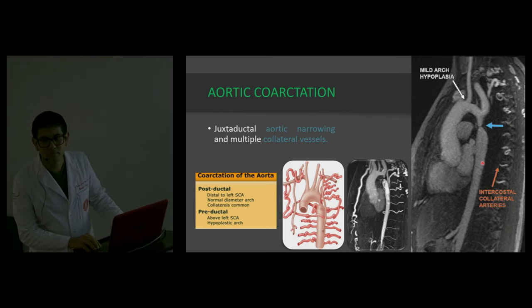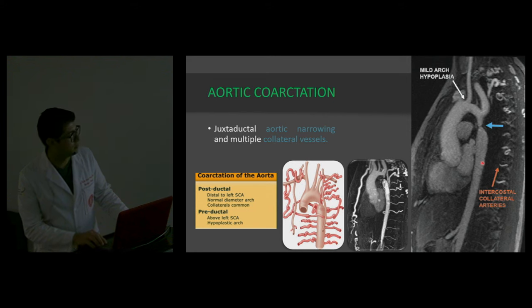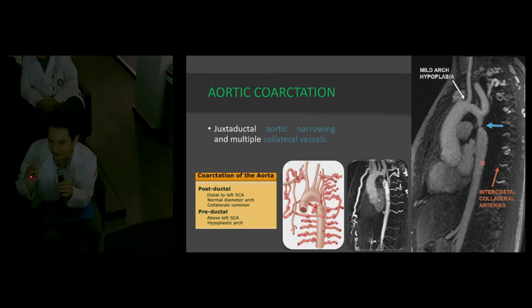I don't know if Franklin already said it. Remember that the aorta is not just the arch, or the ascending or descending. You always have to check the valve if it's possible. Most of the studies are going to be non-gated. So if you can see the morphology of the valve and it has a very frank anomaly, report it. If it's not possible, you say that it's not assessable. Usually the pediatric cardiologist with the echocardiography is going to tell you that they only have doubts here. It's going to be very weird for a child to have doubts in the intracardiac structures, although it is possible.